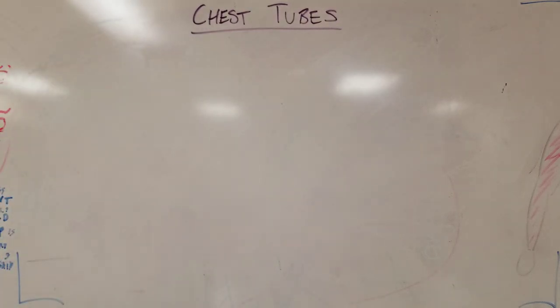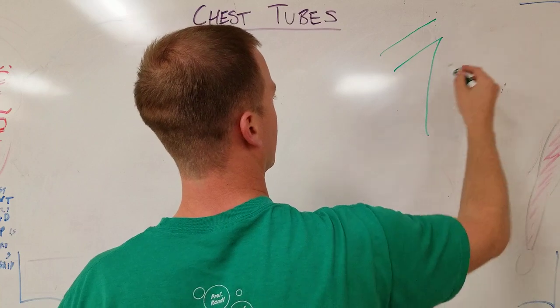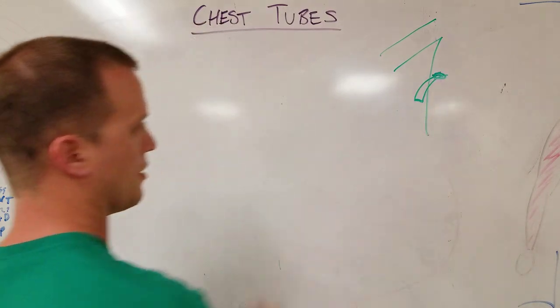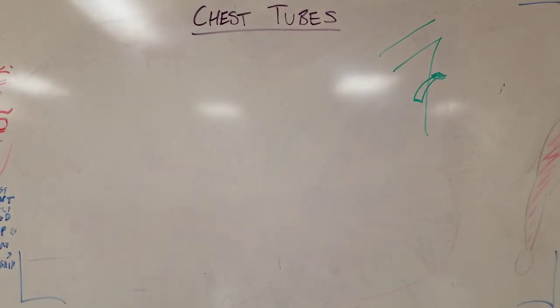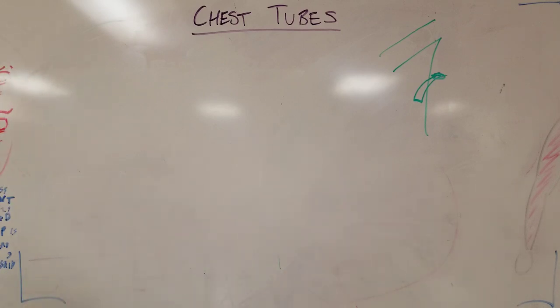So what does a chest tube actually do, right? And so let's say that this is the patient's chest wall, and you already put in your awesome chest tube, and it's coming out, and it's sutured in, and you're like, okay, what do I hook this thing up to? Now, the big thing is you want to create a one-way valve, because you want the patient to be able to breathe and expel gas or expel fluid from their chest to re-inflate their lung, but you don't want air to be sucked back up inside.